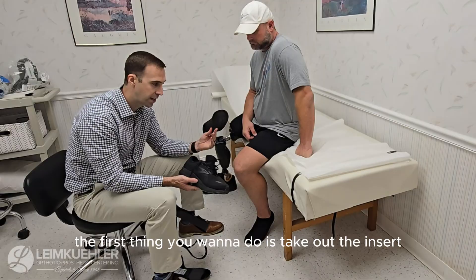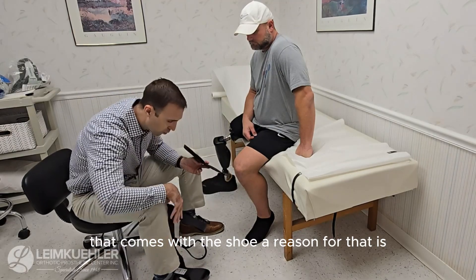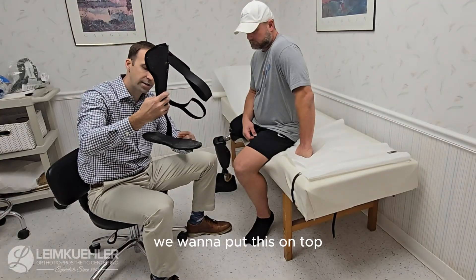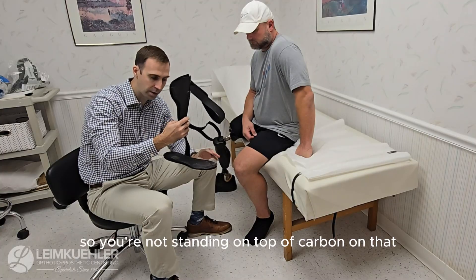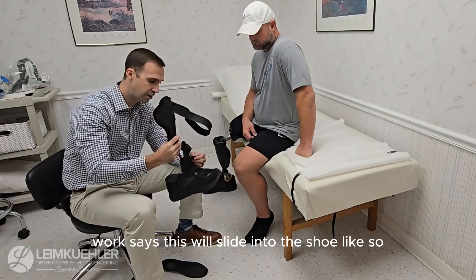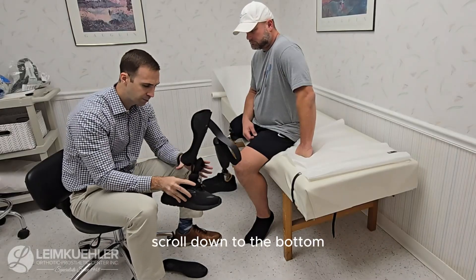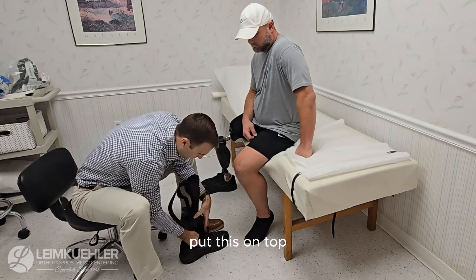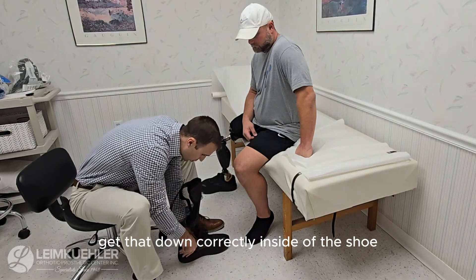Inside of any shoe, the first thing you want to do is take out the insert that comes with the shoe. The reason for that is once the AFO is actually inside of the shoe, we want to put the insert on top to make it a little bit more comfortable so you're not standing on top of carbon. The AFO will slide into the shoe like so, down into the bottom, and then we take the insert, put it on top, and get that down correctly inside of the shoe.